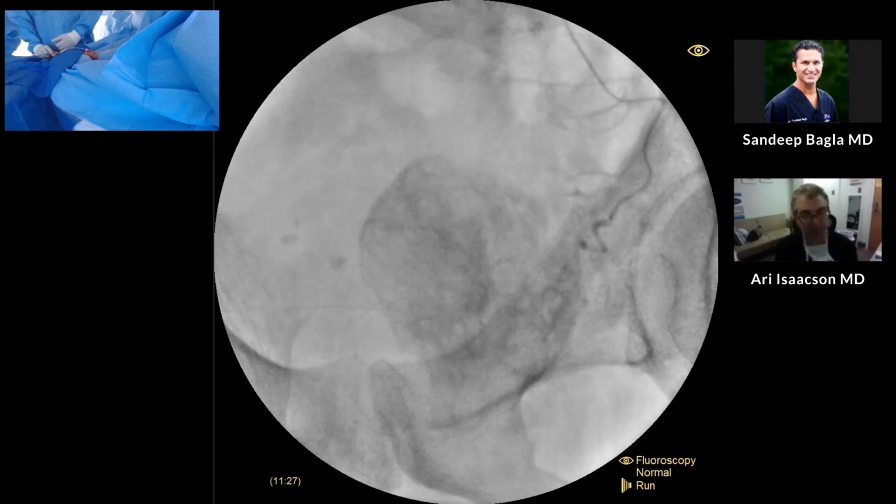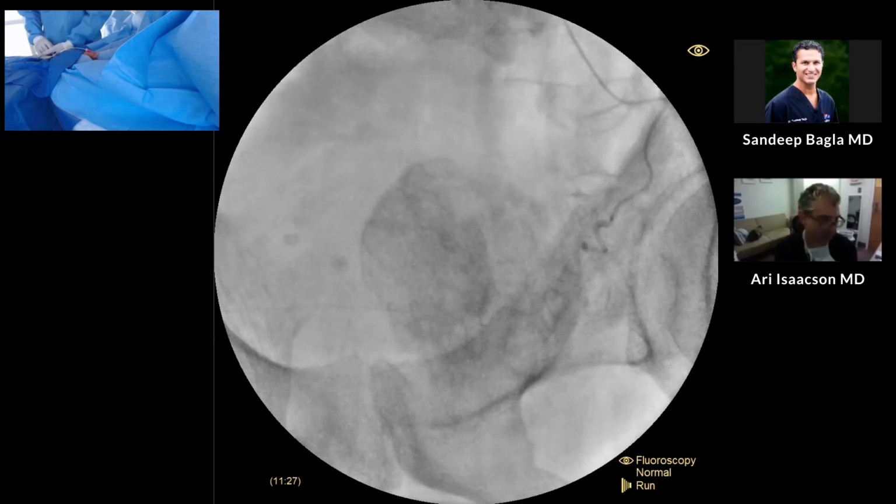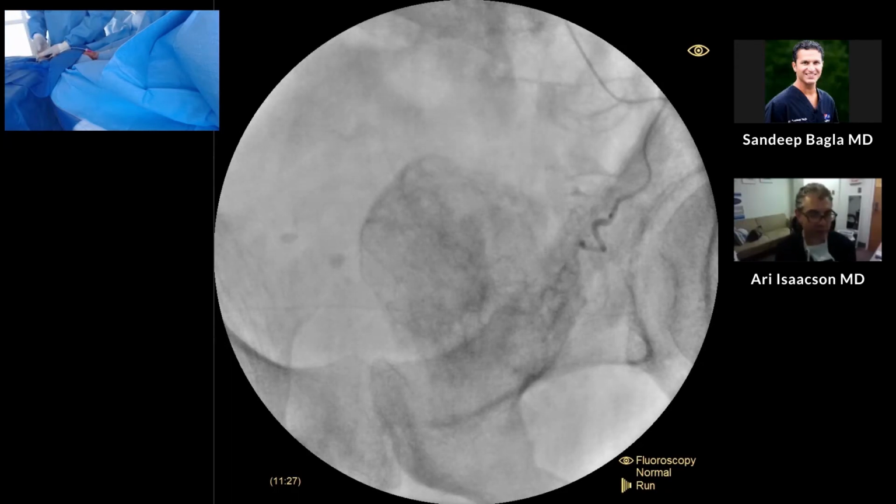I tend to go to the 2.0 immediately, and the reason is that a lot of times you start with bigger arteries, and you can say, "Oh, that's pretty large," but then you might want to get into an anastomosis and place a coil, or you might want to get into one of those distal branches, and I find for those a 2.0 is beneficial. Okay, great. Go straight.